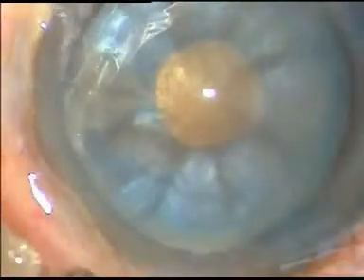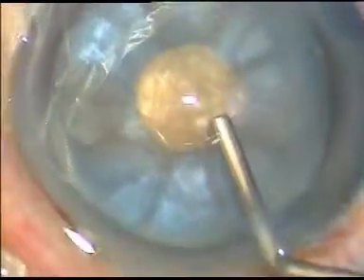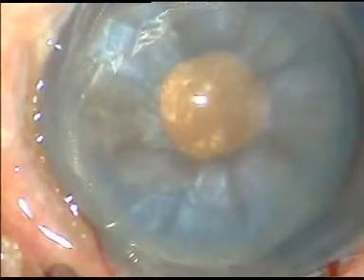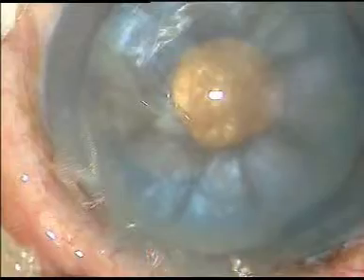The advantage of this small rhexis is that it will not run to the periphery, even if you do bimanual irrigation aspiration of the superficial cortical matter.